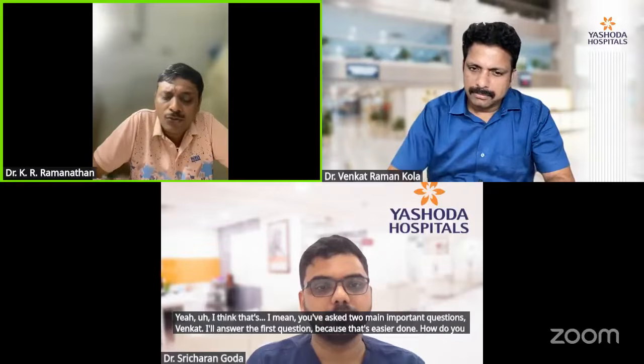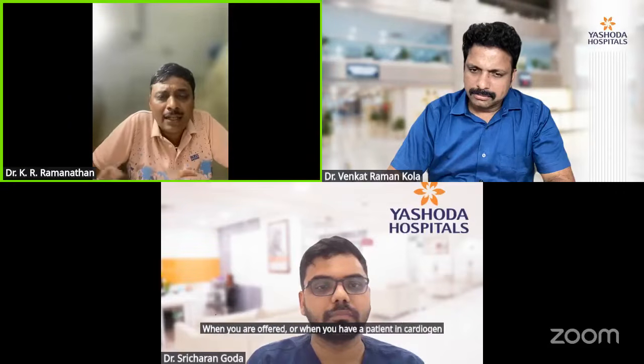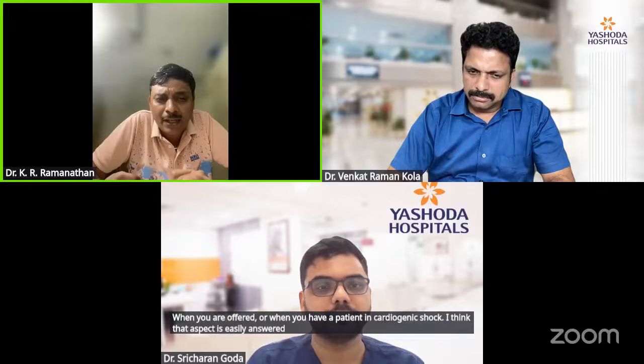How do you choose which mechanical cardiac support device to use when you have a patient in cardiogenic shock? I think that aspect is easily answered, because over the years, with the SCAI classification becoming more popular, we have used it to stratify cardiogenic shock to the point that we now discuss at which stage MCS devices should be inserted.